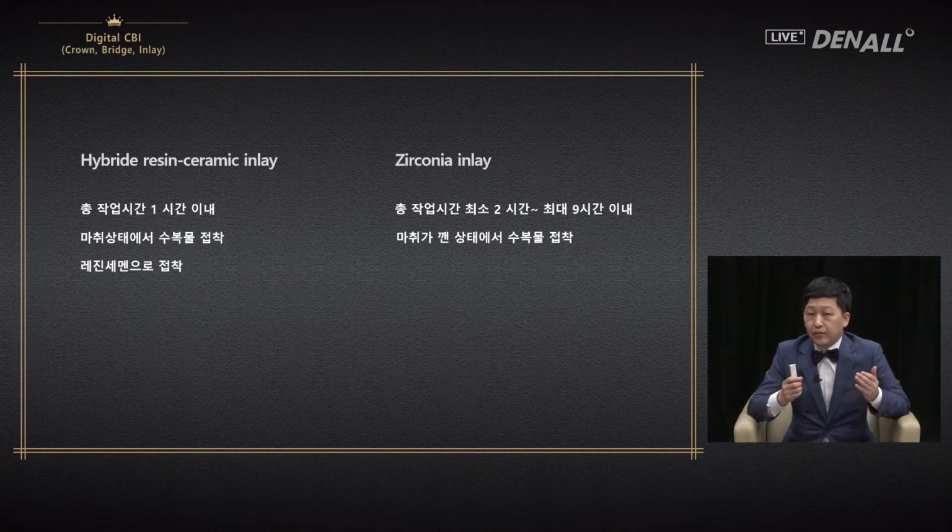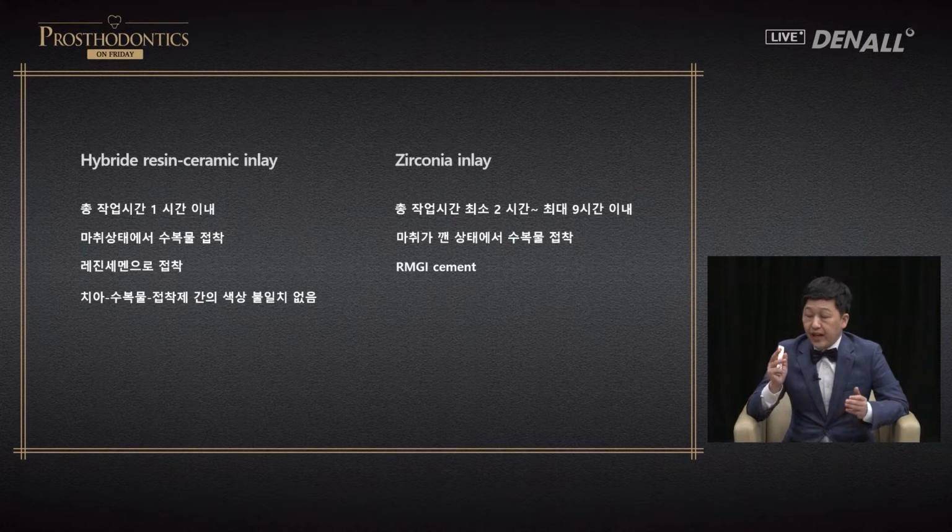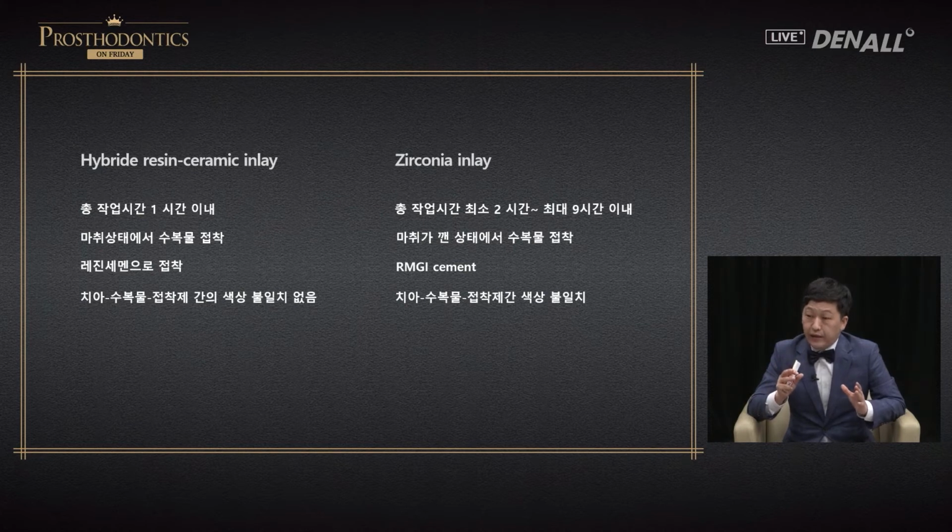Third, in the case of hybrid resin ceramic, inlay can be cemented using resin cement. However, in the case of zirconia, there's a lot of controversy over what adhesive should be used. Fourth, in the case of hybrid resin ceramic inlay, once it is attached with cement, it's difficult to differentiate between the borders. In the case of inlay, depending on how you fire it, for example, if you fire with quick sintering mode, there's a high possibility that there will be imbalance amongst the cement tooth and inlay. You need to be aware of that.